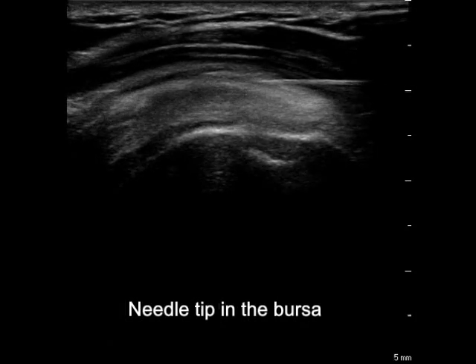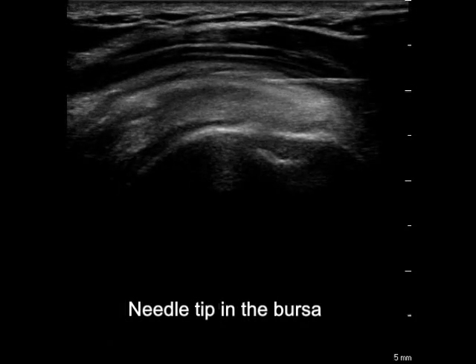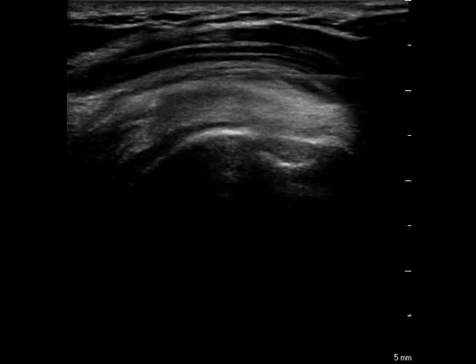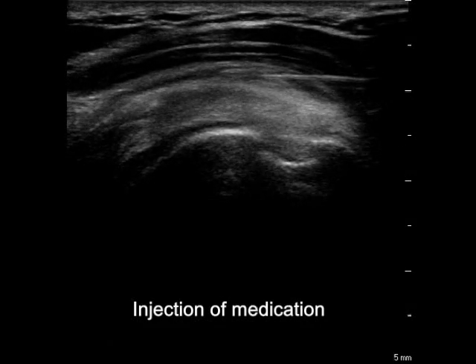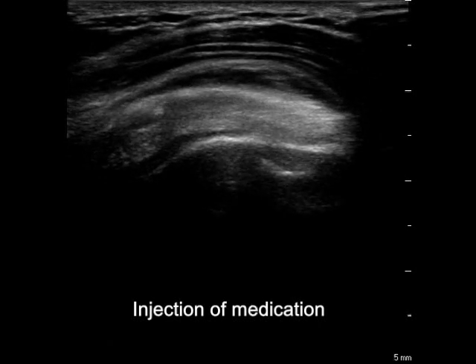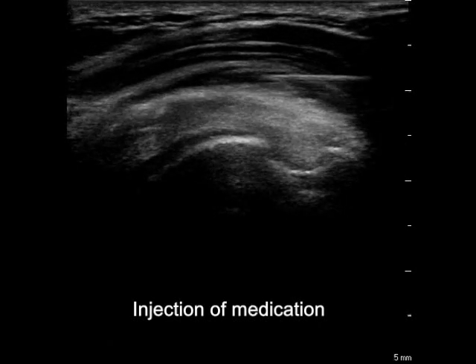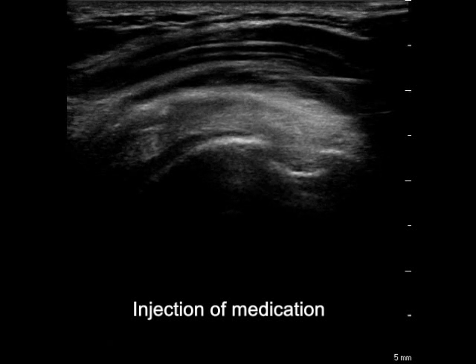As the needle tip goes into the bursa, inject a small amount of fluid to make sure the tip is right in the bursa. Once we confirm the fluid is injected into the bursa, more fluid can be injected safely without leakage to the surrounding muscle and tendons.